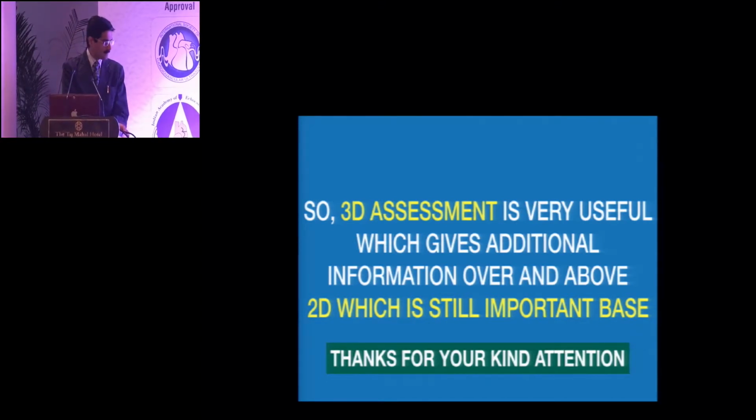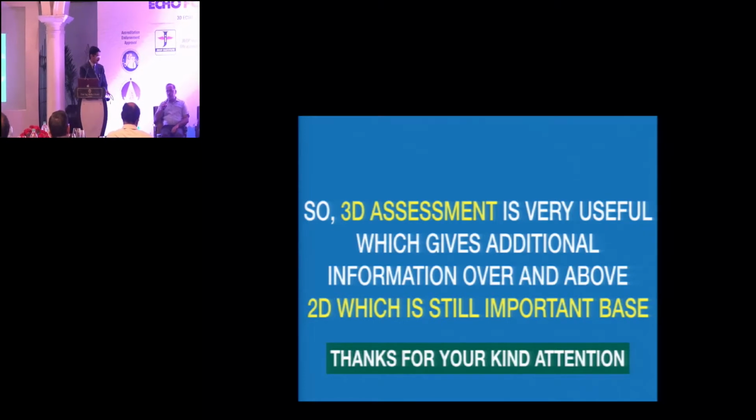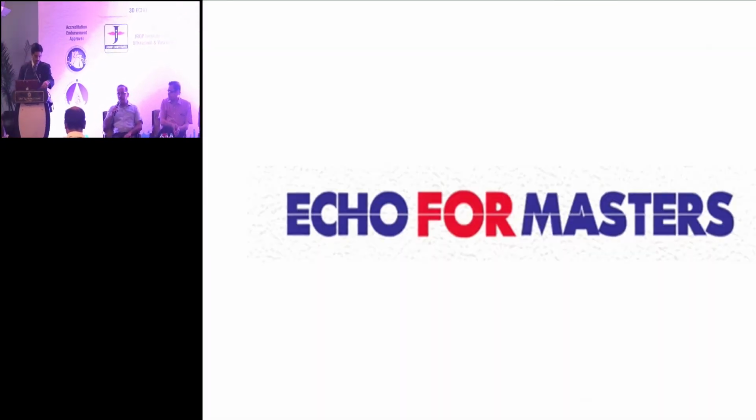Well, thank you, Dr. Shastri. I think it was an excellent presentation, and what I remember was that when 3D started off, the mitral valve was the most important reason for 3D echo, and particularly the mitral valve only. Whenever the surgeon used to decide whether a person has to undergo a replacement or a repair, he used to come and see the 2D images, and then at the end of the day he used to say, okay, when I go inside I will decide whether it has to be a repair or a replacement.